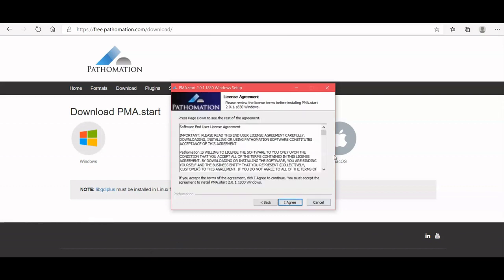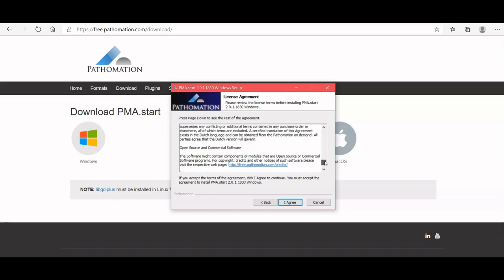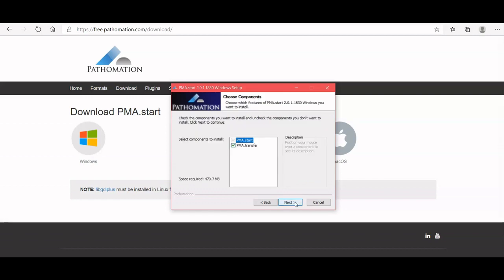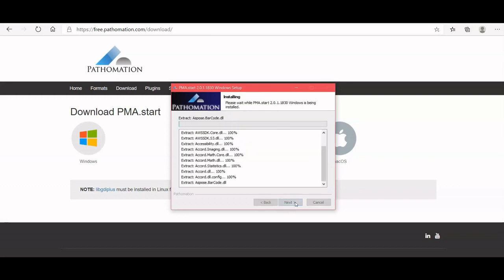You go through our license agreement, and you can choose to install PMA transfer as well, a very handy tool for easily transferring slides.